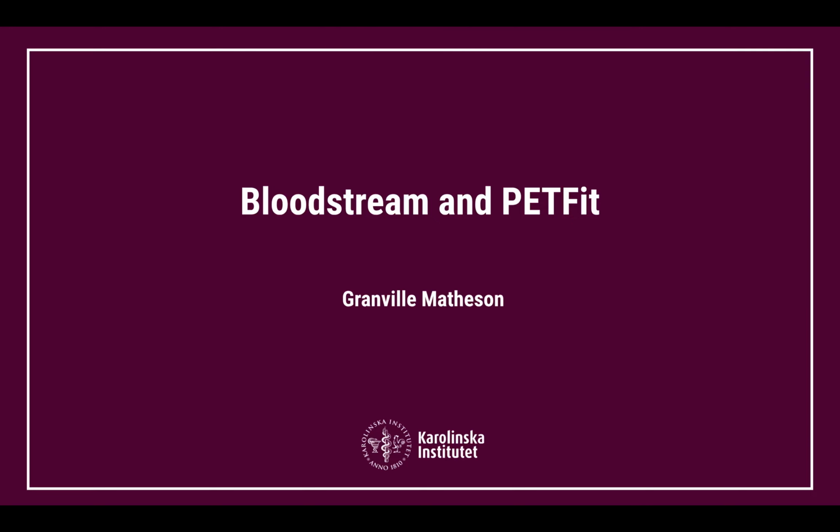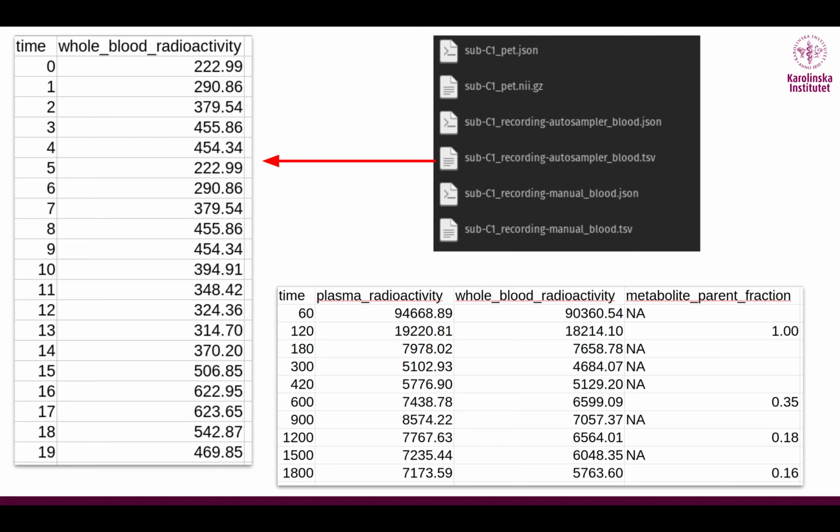I'm now going to introduce my BIDS apps called Bloodstream and PETFit. So starting off with the raw PET data, we have our image file as a NIfTI, and we have the accompanying information in the JSON file. This is called a sidecar file.